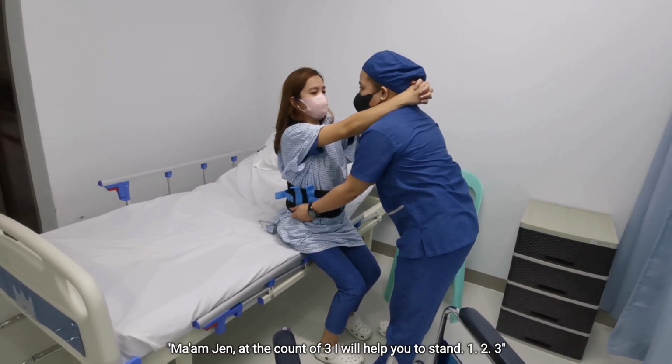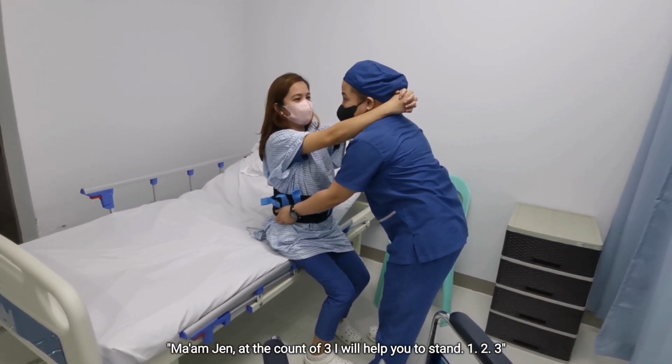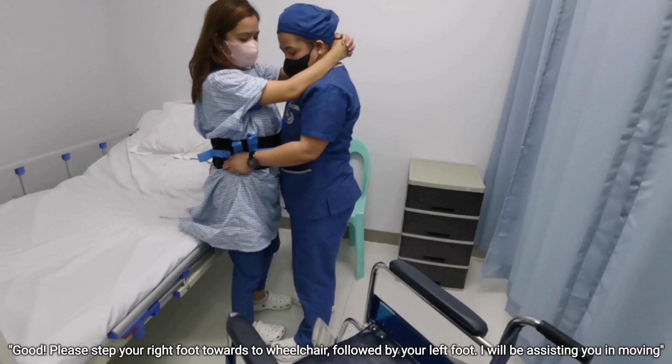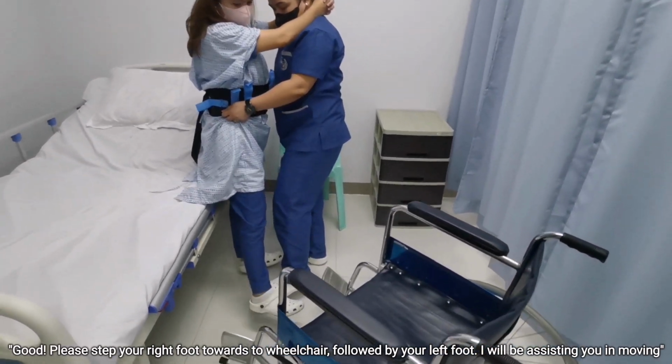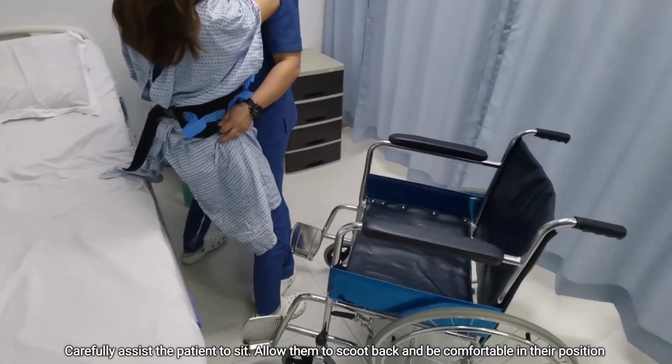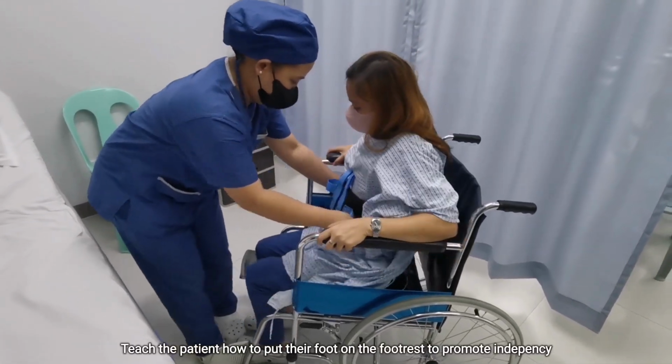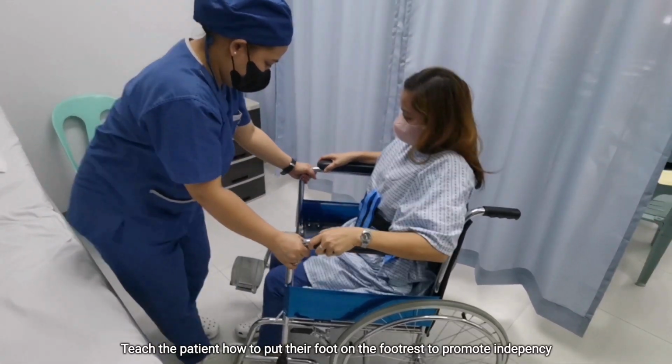Ma'am Jen, at the count of 3, I will help you to stand. 1, 2, 3. Good. Please step your right foot towards the wheelchair, followed by your left foot. I will be assisting you in moving. Carefully assist the patient to sit, allow them to scoot back, and be comfortable in their position. Teach the patient how to put their foot on the footrest to promote independence.